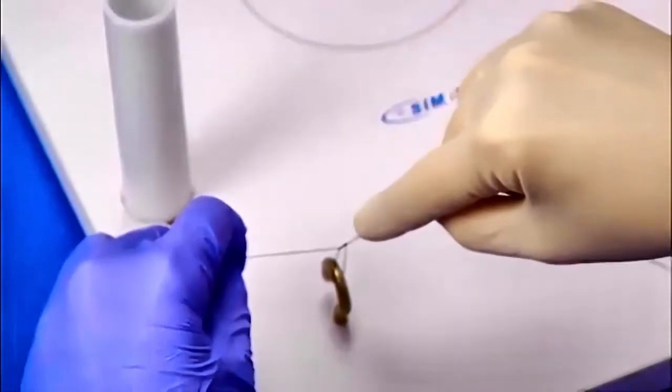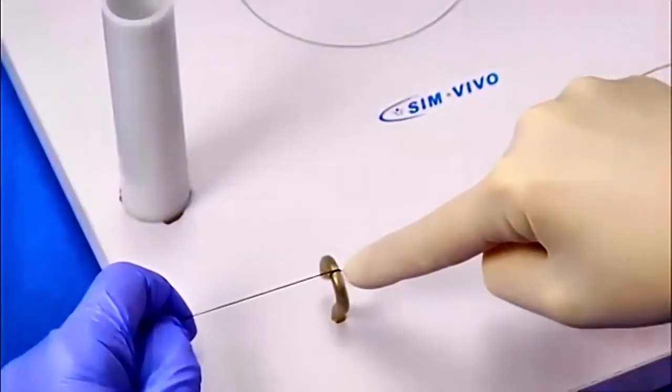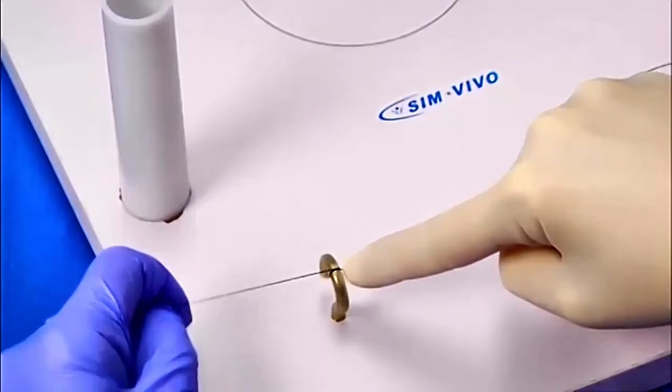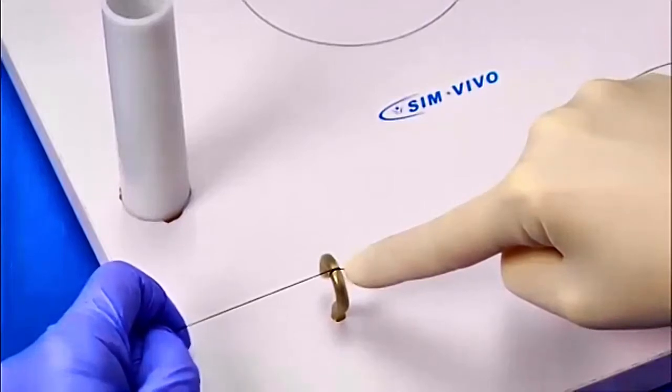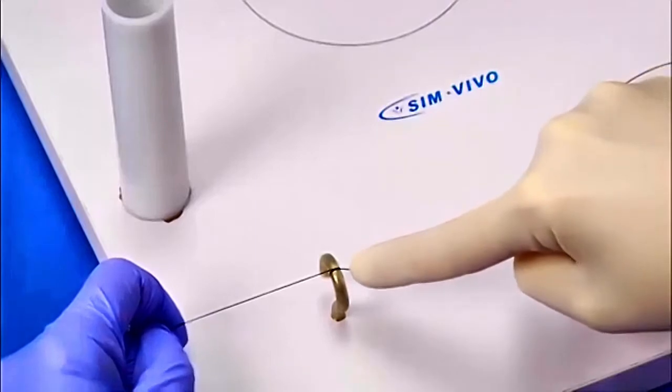Bring it down slowly by keeping the tension close to the throw with the index finger of your active hand and tighten it on the hook in a straight line. Note that the passive hand can hold the end of the suture at a distance from the throw, but at least one finger needs to be near the point to be secured.